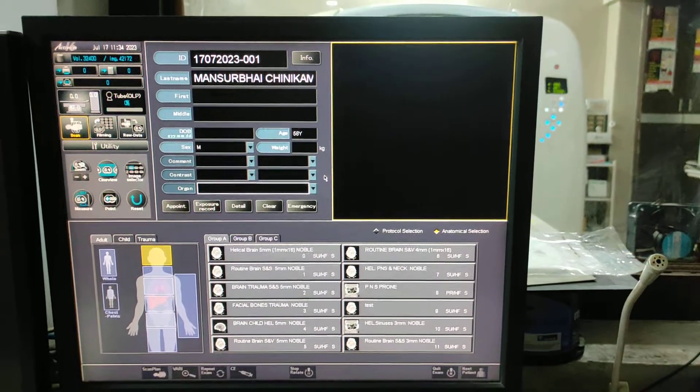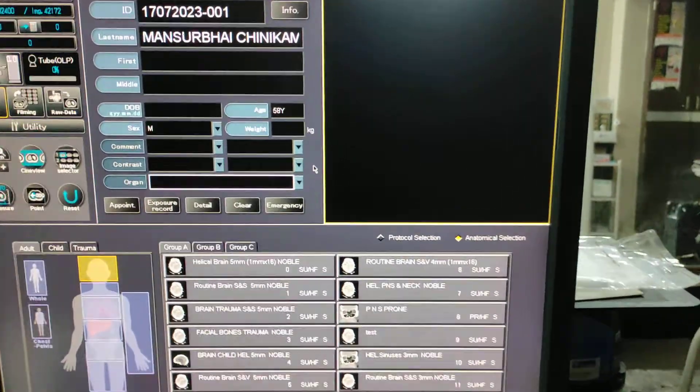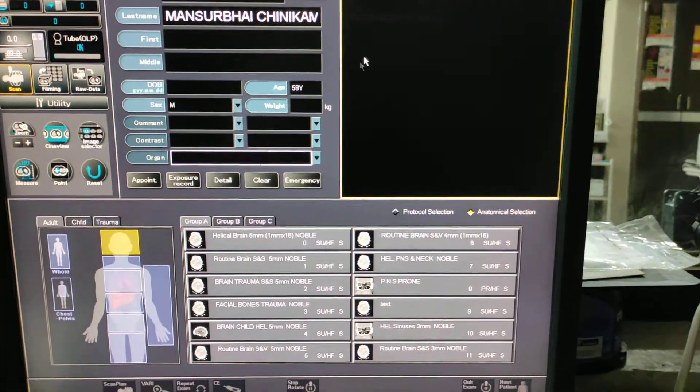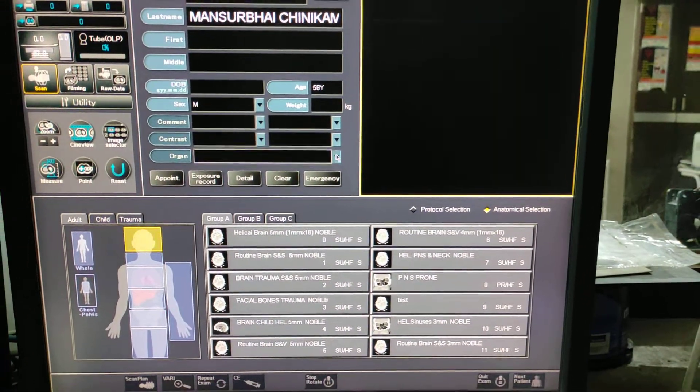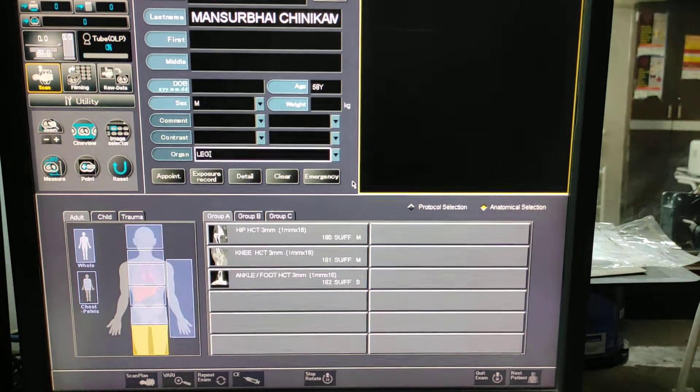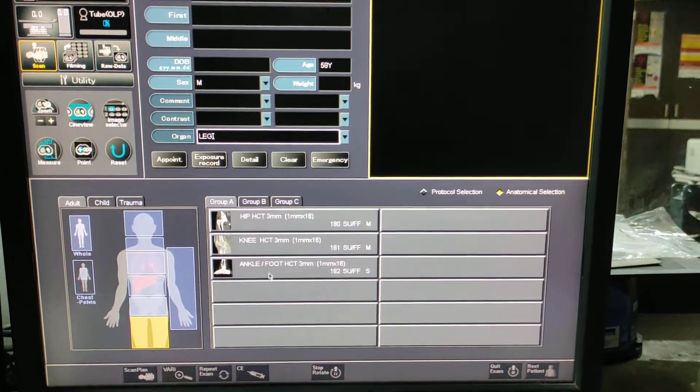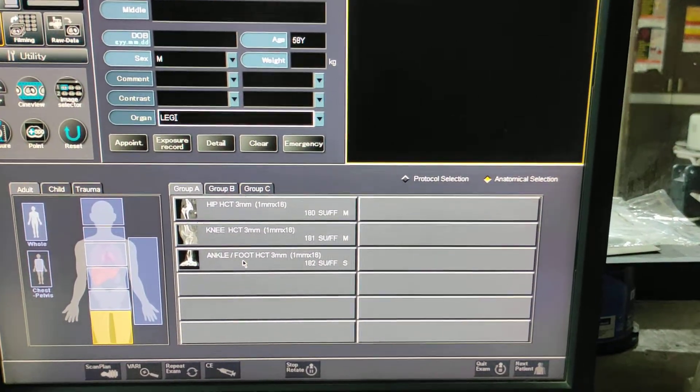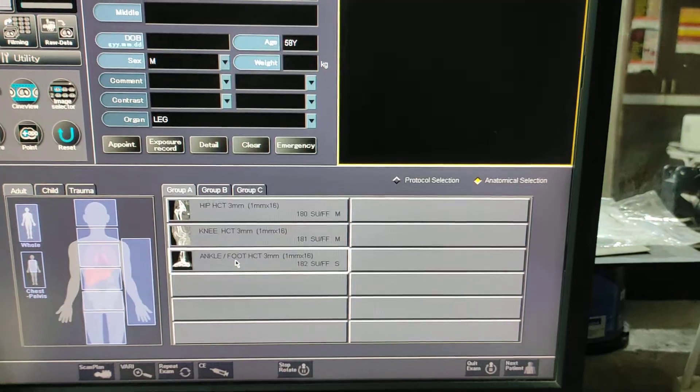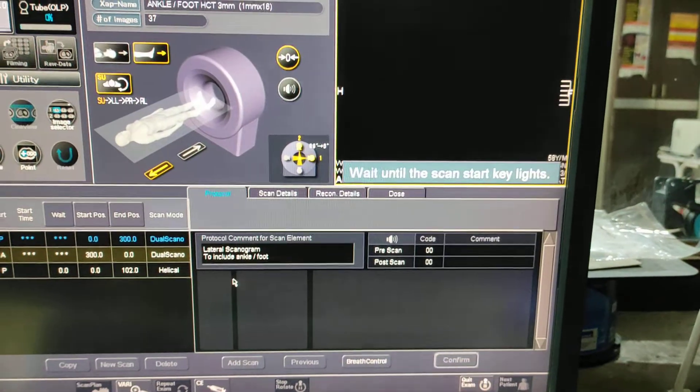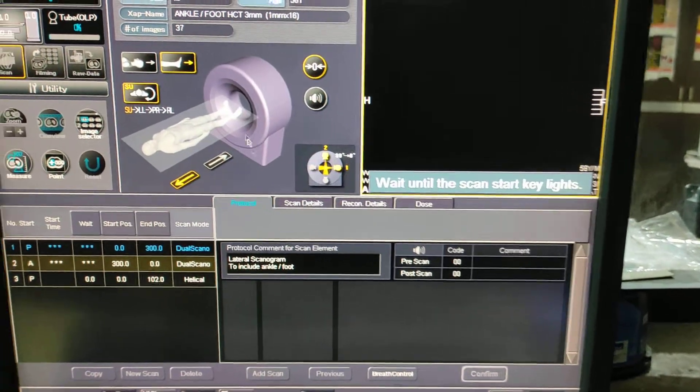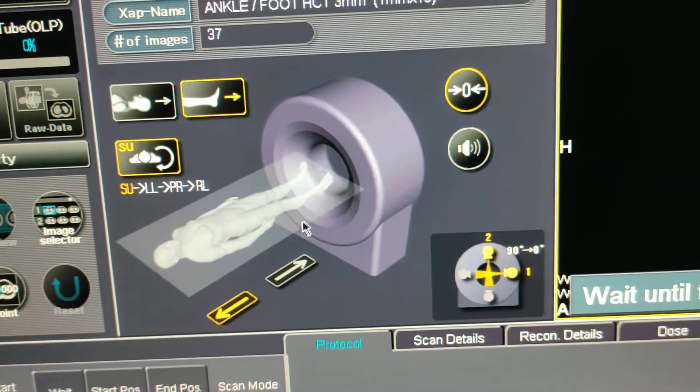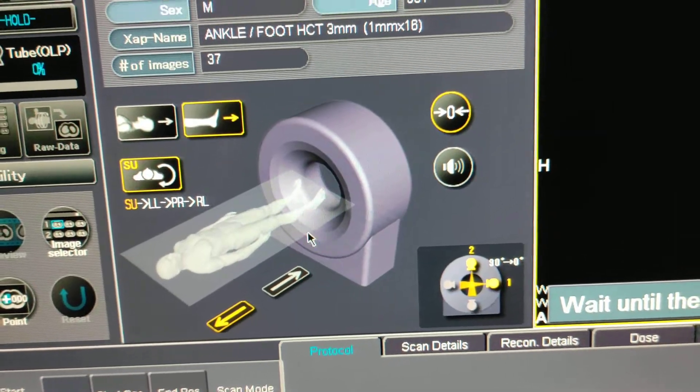Now we are on our entry desk. You have to first fill the patient data. You have to select organ leg, and in leg you have to select ankle. Check over here: supine, feet first.